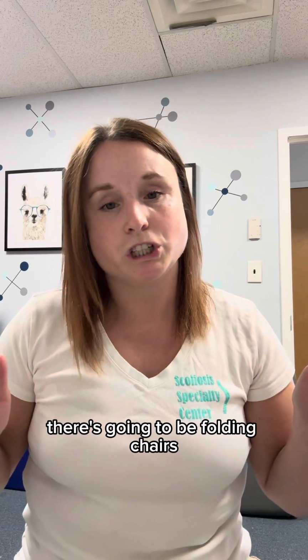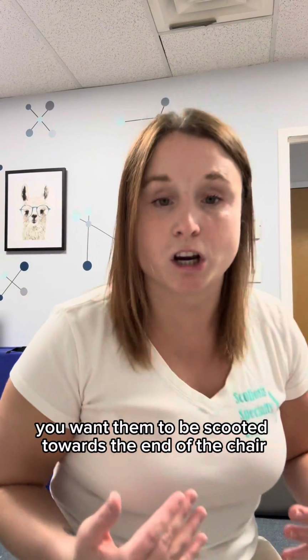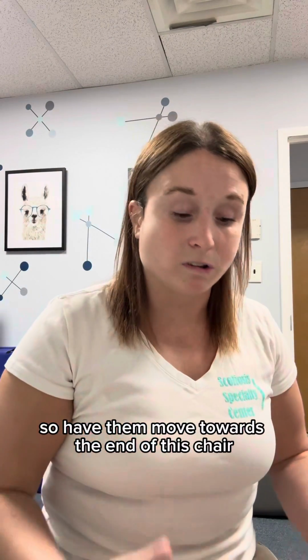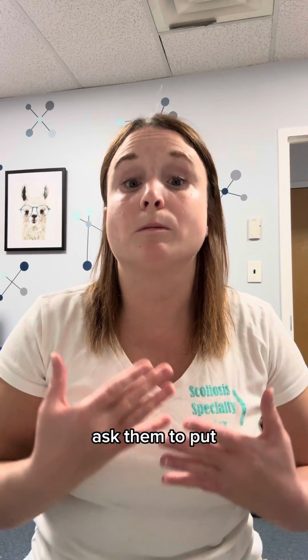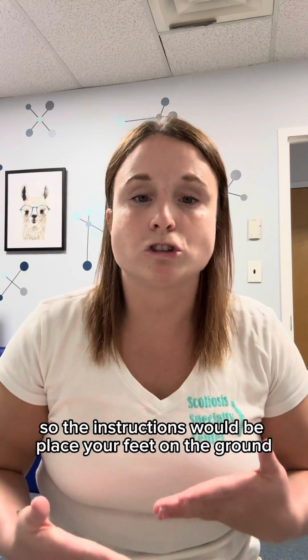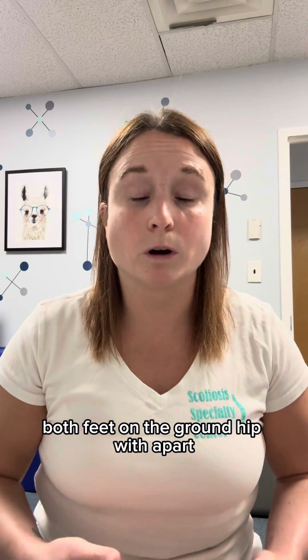There's going to be folding chairs. We're going to have them sit on the chair. You want them to be scooted towards the end of the chair so you have room to move the scoliometer. So have them move towards the end of the chair. Ask them to plant their feet firmly on the ground. Their feet should be hip width apart. So the instructions would be place your feet on the ground, both feet on the ground, hip width apart.